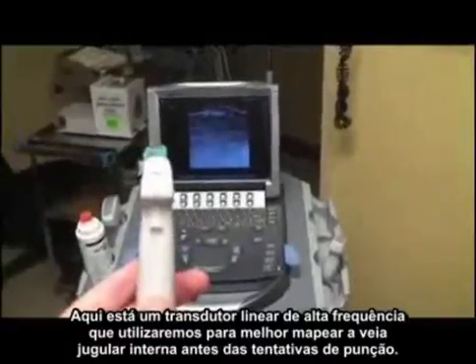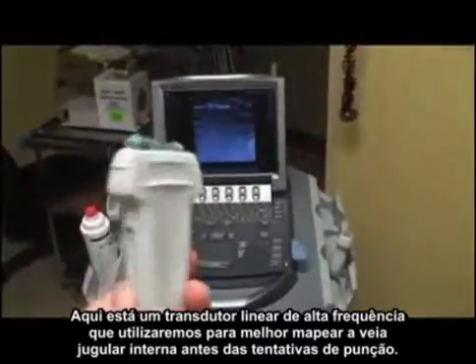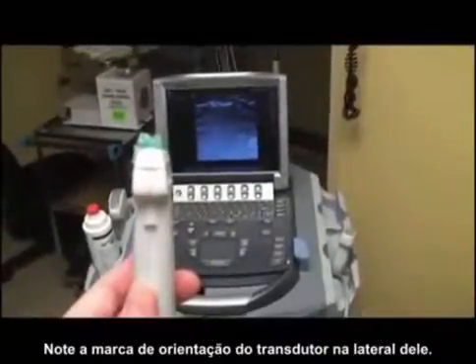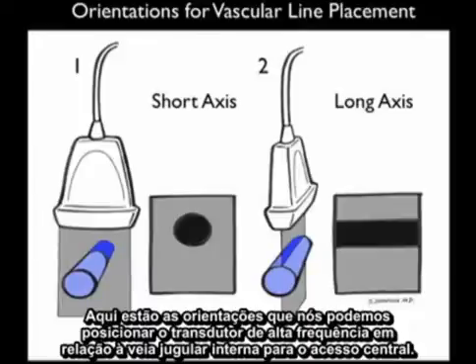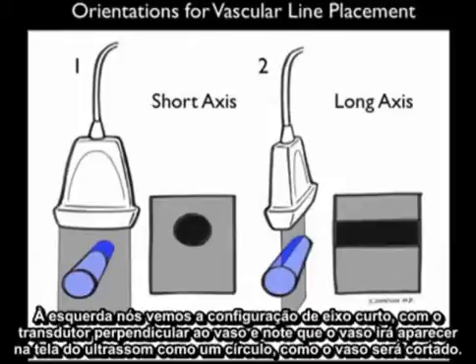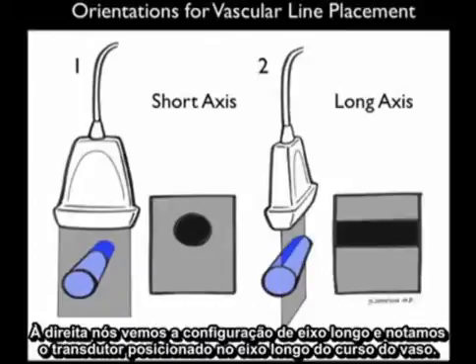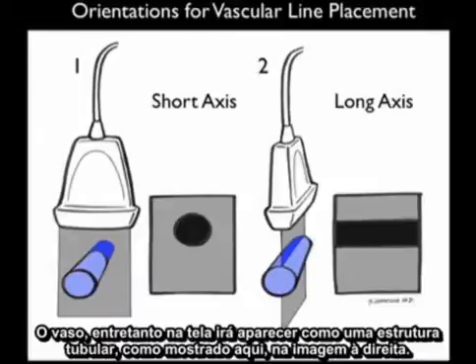Here's the high-frequency linear array probe that we'll be using to best map out the internal jugular vein before puncture attempts. Notice the probe marker to the side of the probe. Here are the orientations we can place the probe in relation to the internal jugular vein for vascular line placement. In the short axis configuration, the probe is perpendicular to the vessel, and the vessel will appear on the ultrasound screen as a circle, as the vessel is cut end-on. In the long axis configuration, the probe is placed along the long axis course of the vessel, so it appears as a tubular structure on screen.